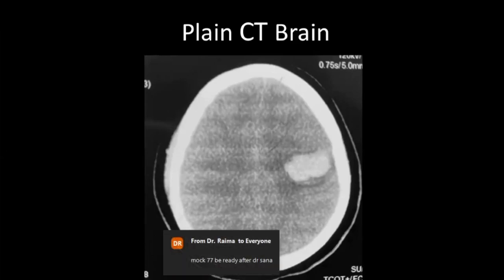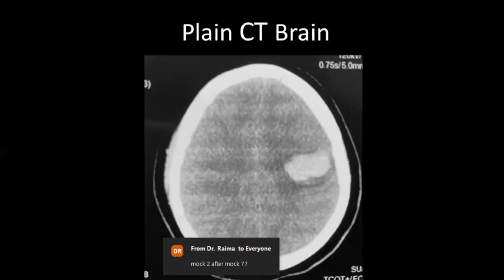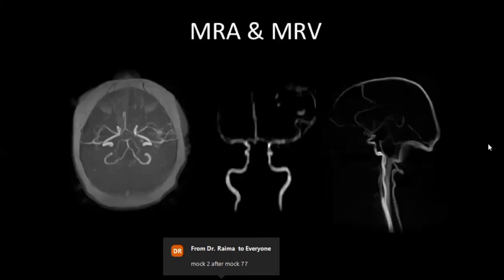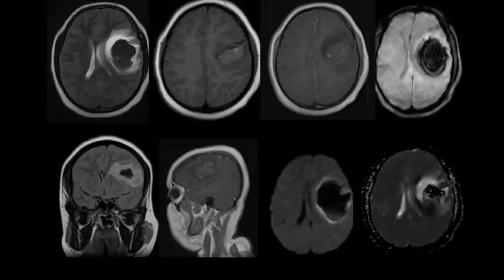Okay, what hematoma? What are you going to advise the patient next? Next, I would like to see the MRI of the patient to stage the hematoma. So this is the MRI of the patient? Okay. Yes, this is the MRI. So now I'm provided with the demonstration of hematoma.